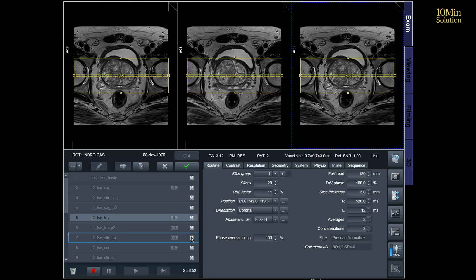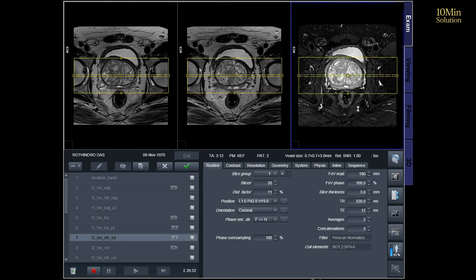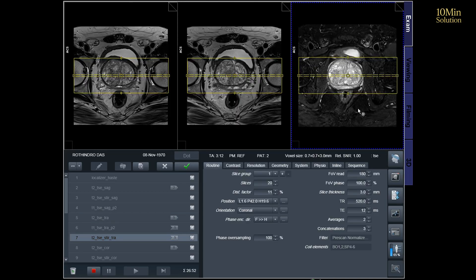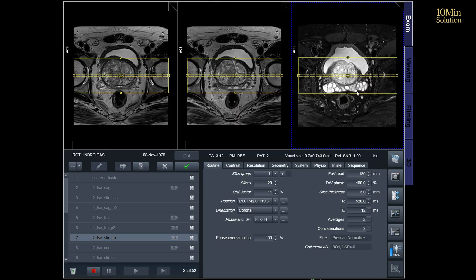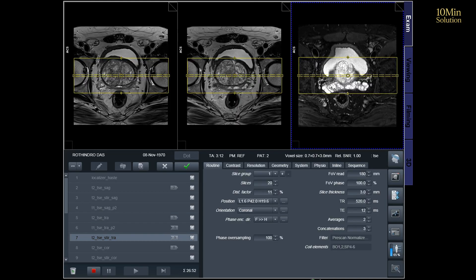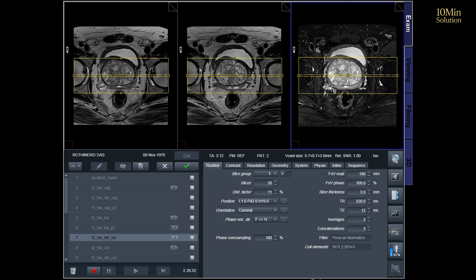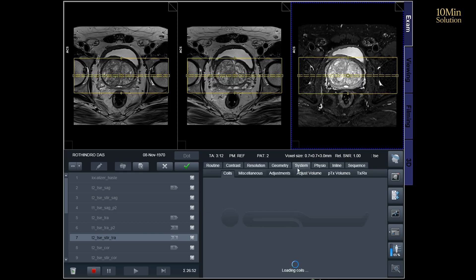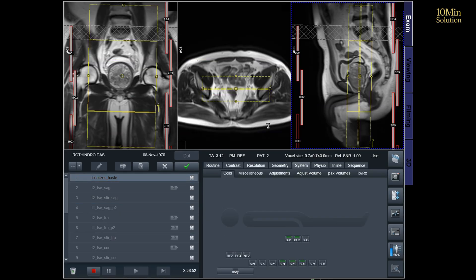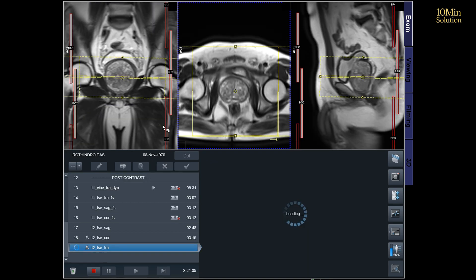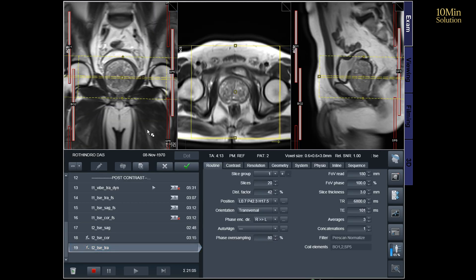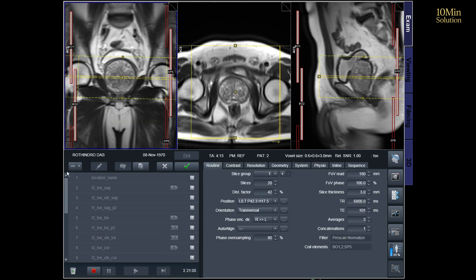Additionally, to minimize artifacts stemming from arterial pulsation and breathing, consider incorporating saturation bands on the top and front of the coronal block.